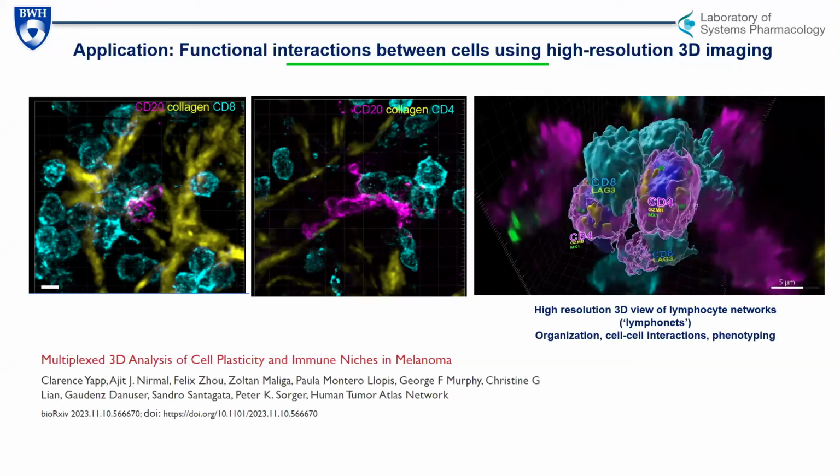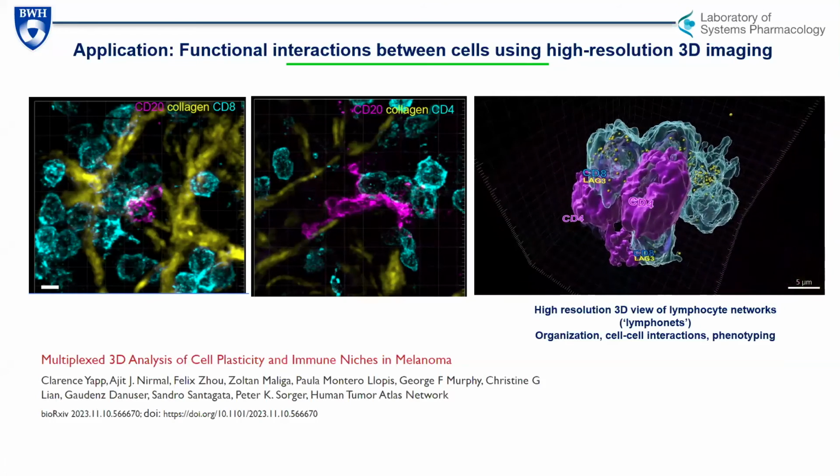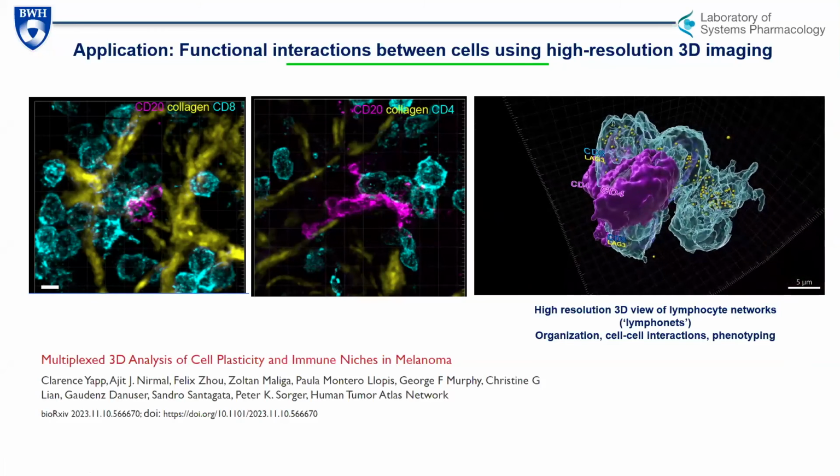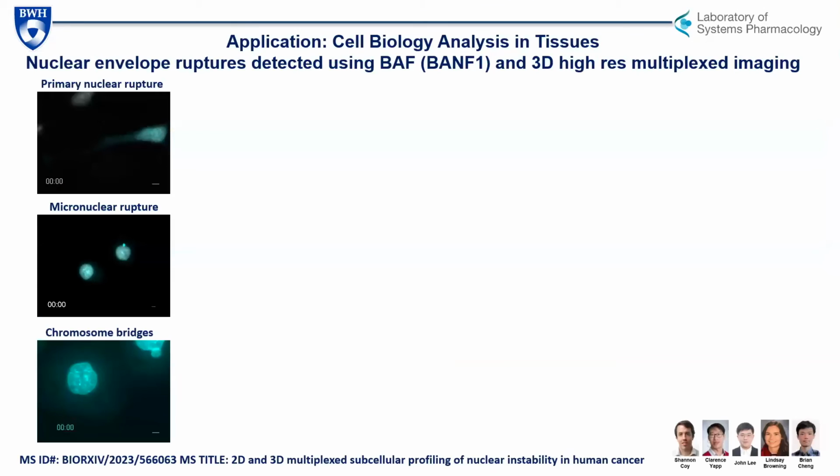And even cell typing is remarkably enabled, I would say, by this high resolution imaging that's now possible with these newer methods of cyclic immunofluorescence and confocal microscopy. And here I just want to end with this kind of view of the future, I think, where we're going to hopefully be able to link the imaging we do in cell lines with the imaging we do in tissues.